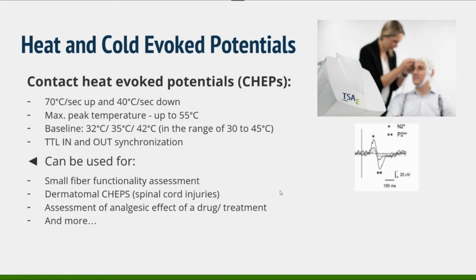What is it good for? What can you use this nice technique for? Contact heat evoked potentials. So first of all, since these are painful heat stimulation, we understand that it is mediated by small fibers. So if something is wrong in small fibers, we will see smaller amplitude, we will see longer latency, and therefore it can be a good tool for the assessment of small fiber functionality of the patient.